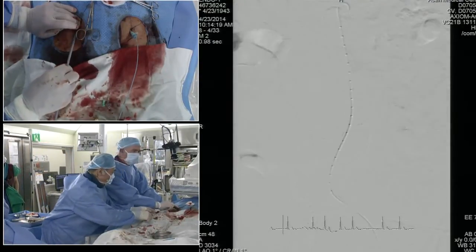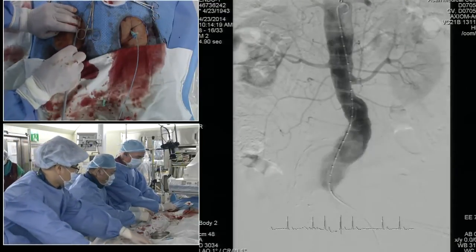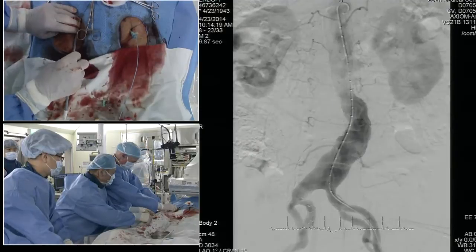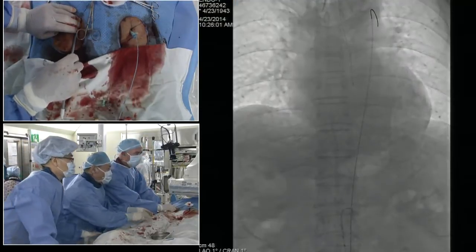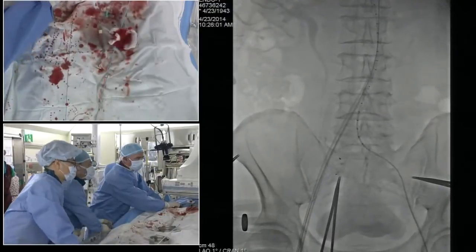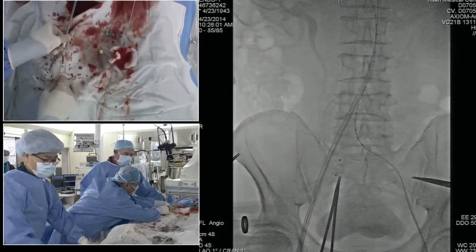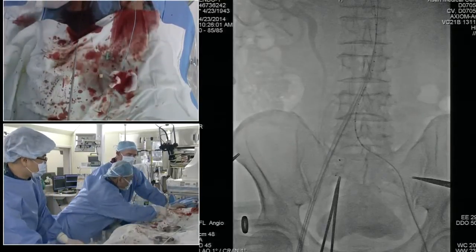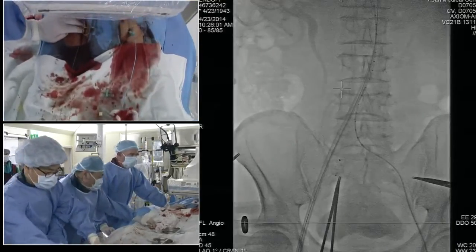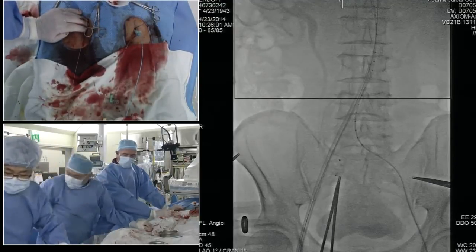So now we're dilating the femoral artery up here a little bit with a 14 and then a 16 dilator. Let's look on 4 here real quick. Our wire is still good. Okay, great. Okay, we can come on out. But that's a good question in terms of how you would address this bifurcation if we don't get a seal, and that'll certainly be a challenge.